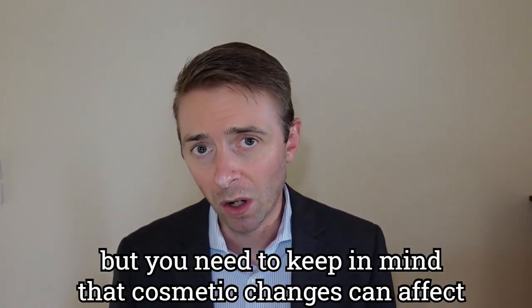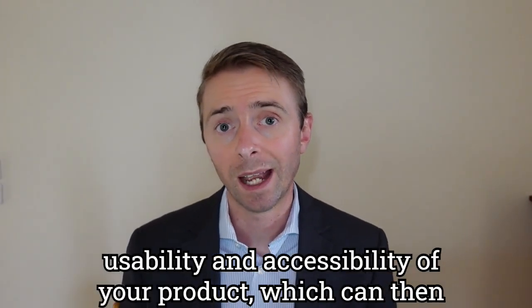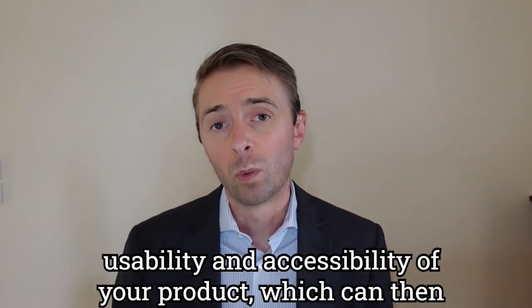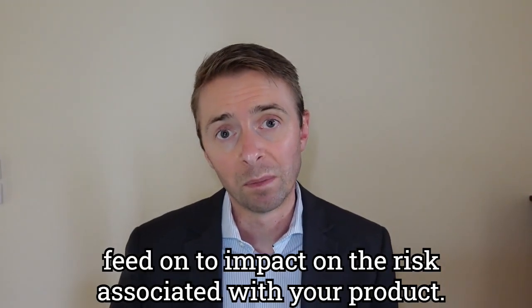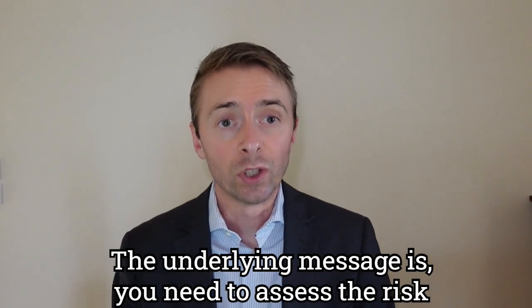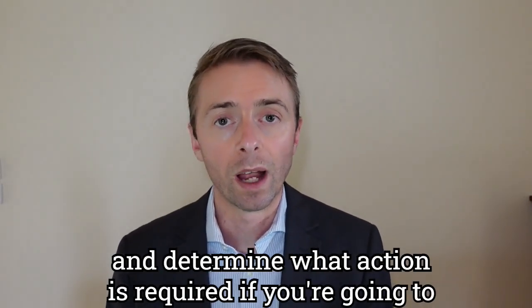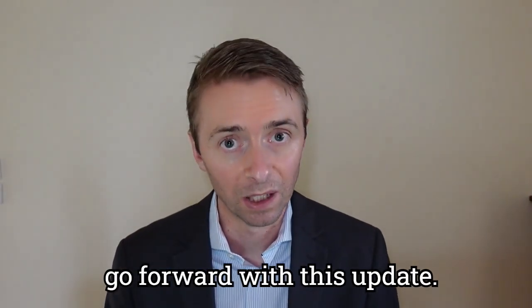But you need to keep in mind that cosmetic changes can affect usability and accessibility of your product, which can then feed on to impact on the risk associated with your product. The underlying message is you need to assess the risk and determine what action is required if you're going to go forward with this update.